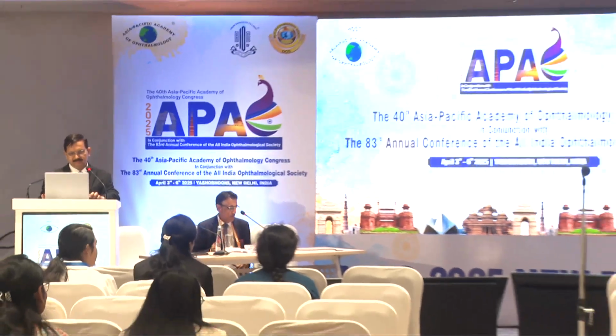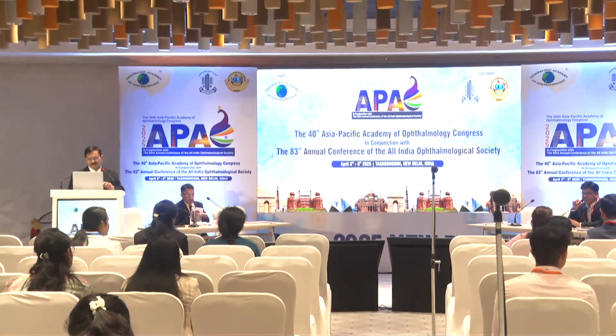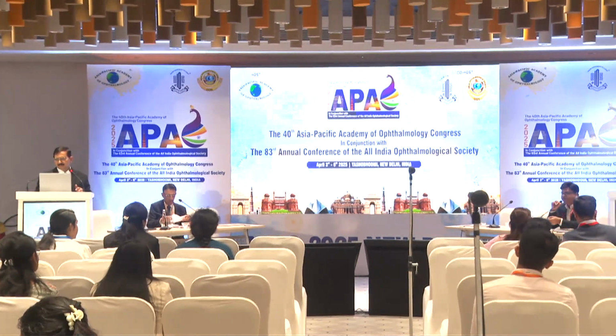Thank you so much for that. This was a basic talk for you all, PGs. Whenever you are planning for endothelial keratoplasty, the first step is always manual DSEK. Once you master that, then automated, then DMEK.